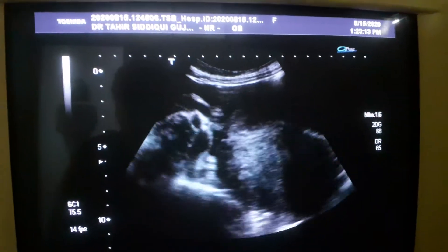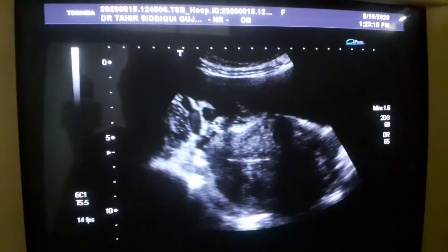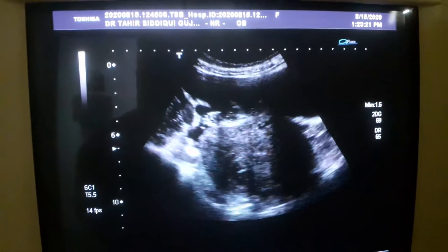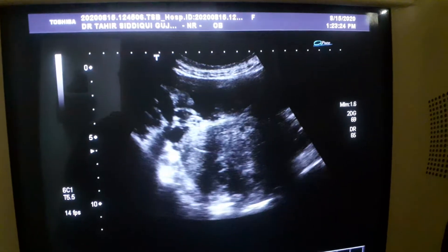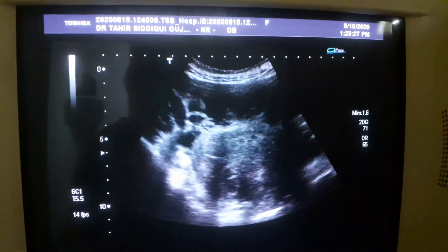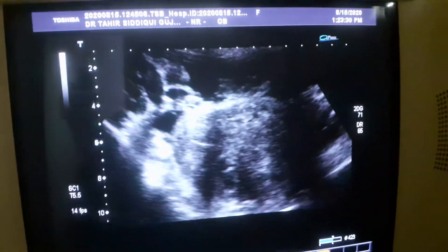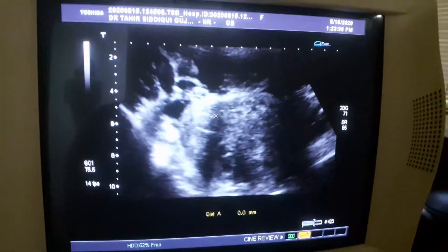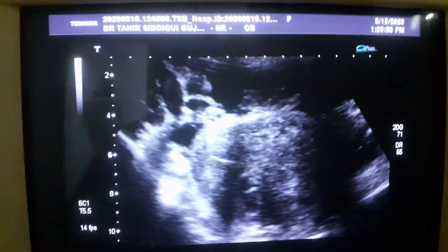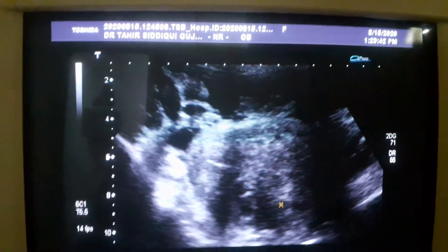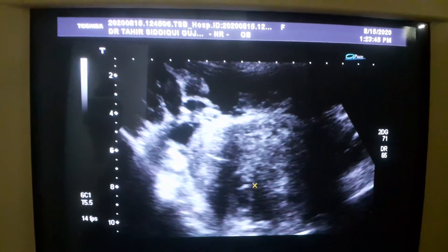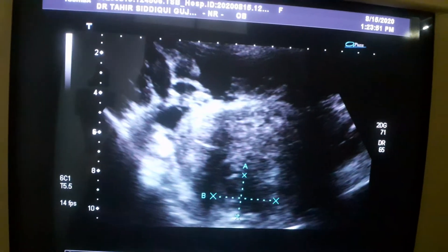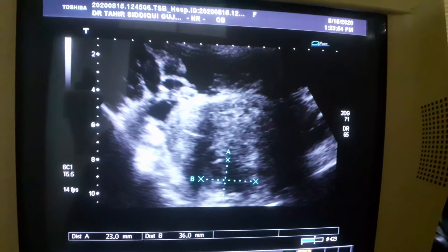This is the uterus of a 40-year-old female. You can see there is a small rounded hypoechoic area within the endometrial canal. This white line in the center is the endometrial canal, and this is a small fibroid within it, located in the posterior wall in an intramural location, measuring 36 by 23 mm.